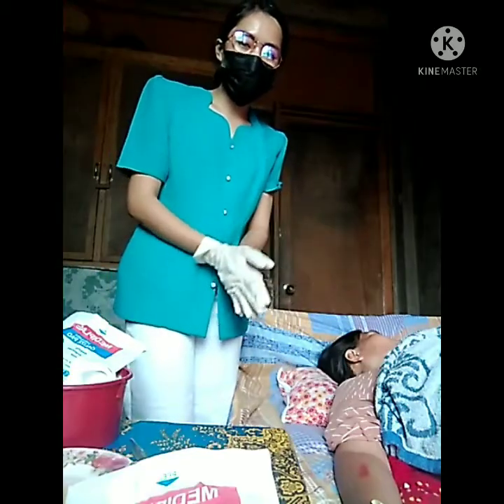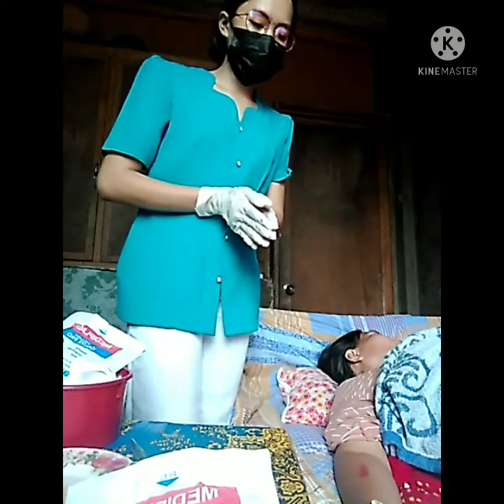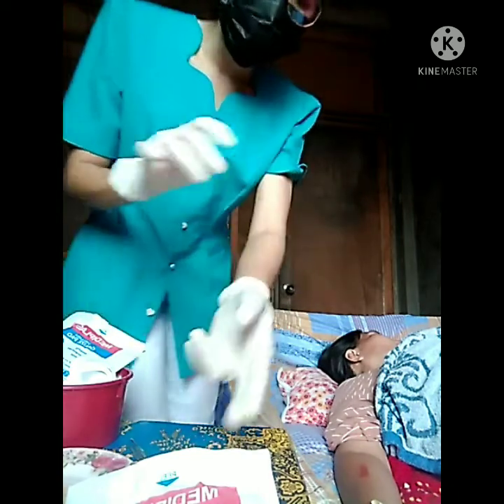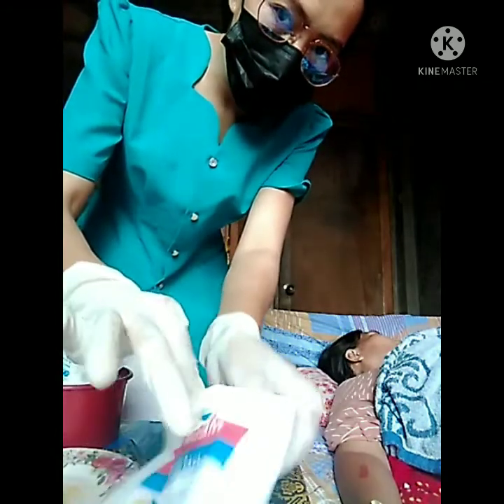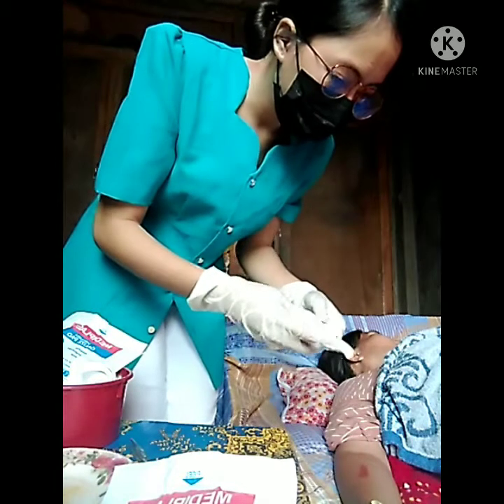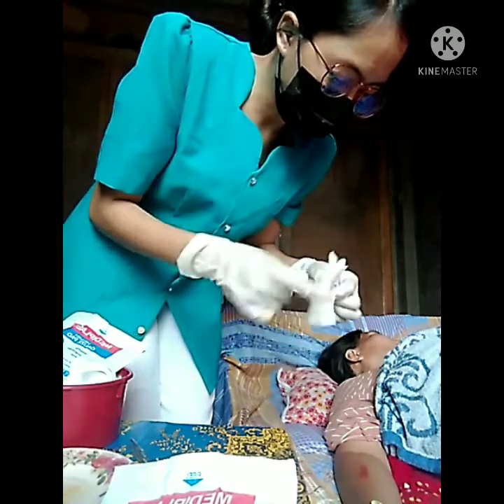And the next step is to apply sterile dressing to the incision or wound. So we need to apply this sterile gauze as the contact layer.